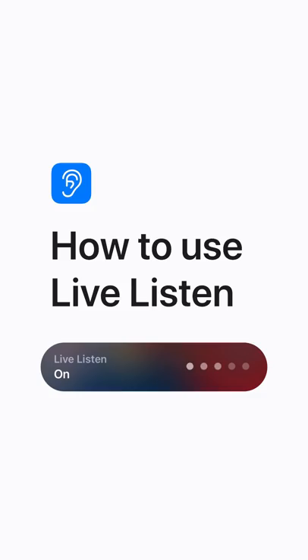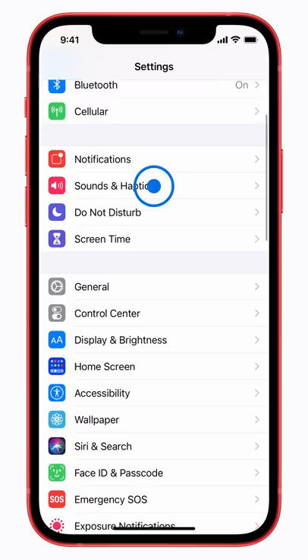Live Listen uses the microphone in your iPhone or iPad to pick up audio and send it to your compatible headphones. Here's how. In Settings, tap Control Center. Tap the Add button to add Hearing.